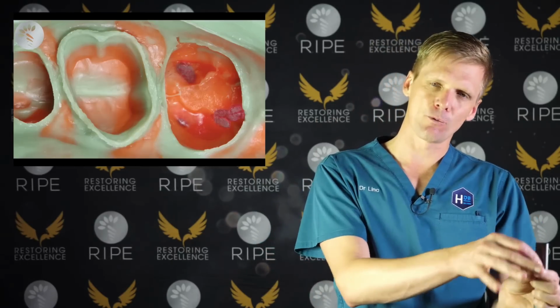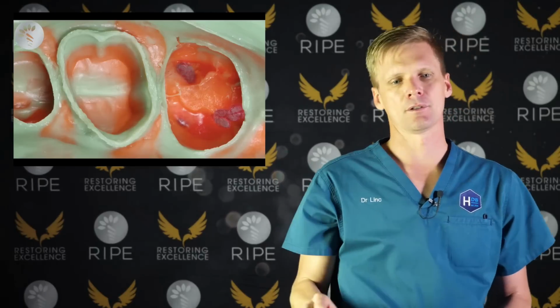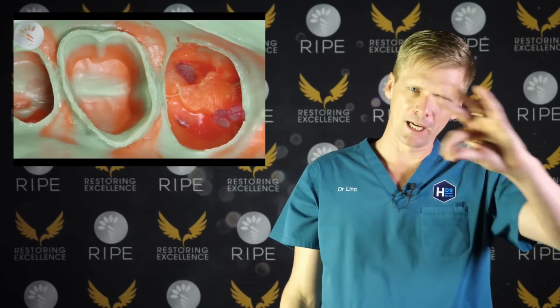Now the last thing is that when you lift the cord out, you don't just grab it and reef it out like that. You grab the cord and you very delicately lift it out around the tooth. Now when we get into multiple preps, it's a little bit trickier and I might not have time for that tonight. But pull the cord out very gently.